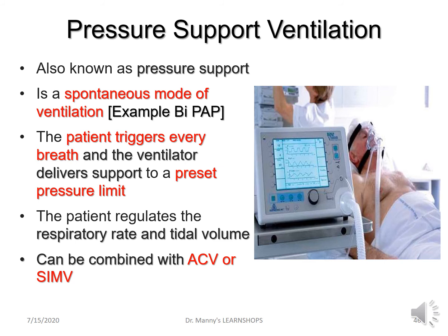The patient regulates the respiratory rate and the tidal volume. And as I said, it can be combined with other modes of ventilation. But this is for patients who are breathing spontaneously because it supports their spontaneous breathing when they may be recovering from long-term ventilation, and it helps them build up their ability to breathe spontaneously with a little bit of support. Pressure support ventilation.